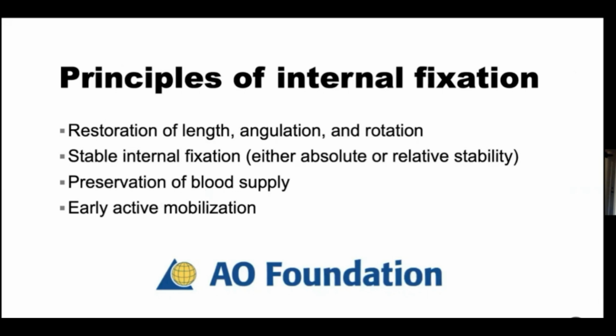So, principles of internal fixation. These are 4 principles that we as orthopedic surgeons really understand to be true and important. And certainly they've been modified over time. This is kind of the basis of what we think about in terms of what the principles of internal fixation are. What are you trying to achieve with the construct that you're building? So we talk about the first one being restoration of length, angulation, and rotation.